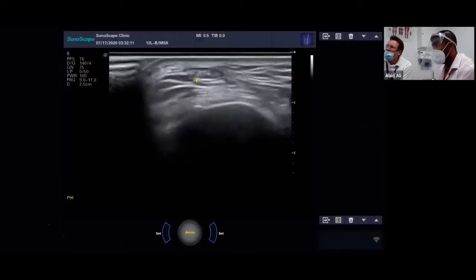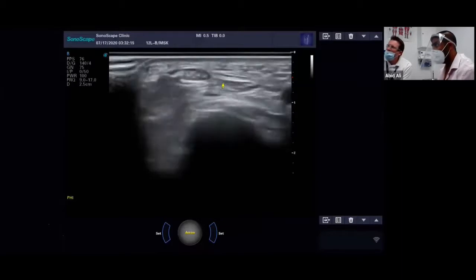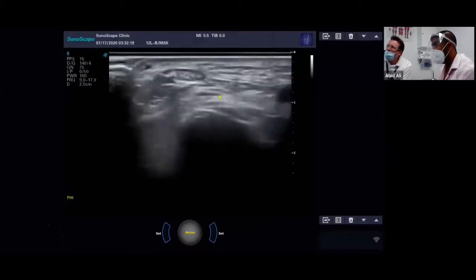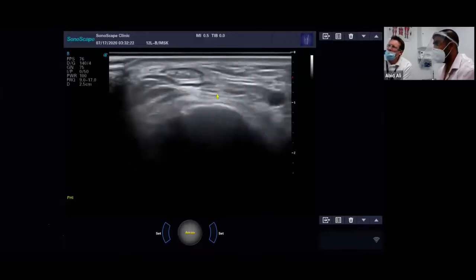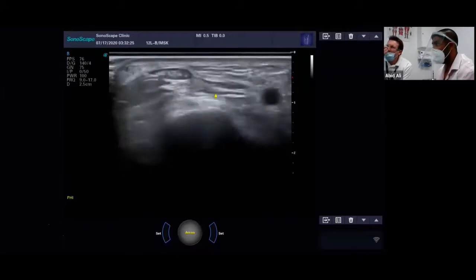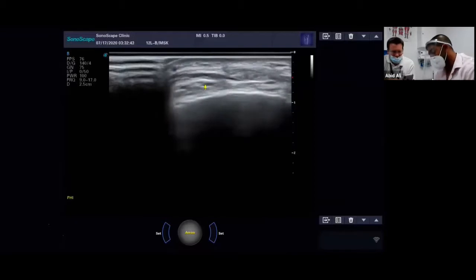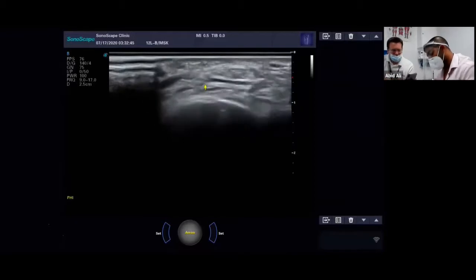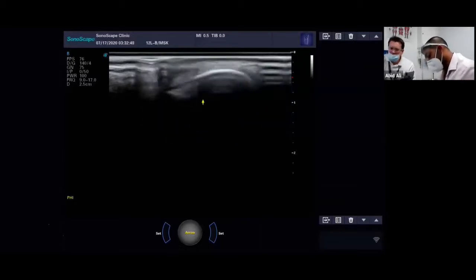I think in general, any tendon you interrogate, you should look at it in the long axis and the short axis. And the long axis, you'll see longitudinal and transverse tears, and the short axis is where you'll find the intrasubstance tears. Yeah. The easy way for you guys is just ask your patient to dorsiflex the ankle. As long as there's not too much edema around there, that'll make it a lot easier for you to find it. Usually they're quite prominent. Adrian's is not, but I can feel it. Yeah, it's a simple way.